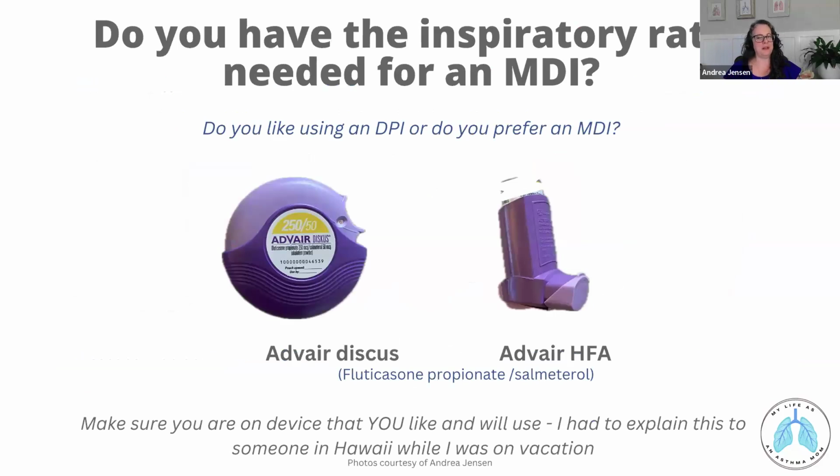So do you really have the inspiratory rate needed for an MDI, the metered dose inhaler, or the dry powder inhaler, whichever one you're using? Make sure that you have one that you like and you will actually use.